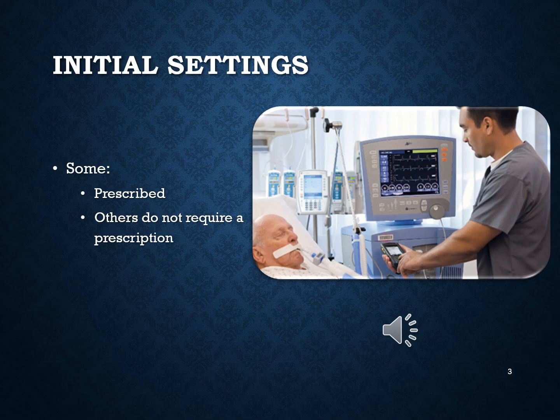Some settings will be prescribed for you, and we'll talk about each one of those here shortly, but I do want you to know that there are some settings that will not be prescribed for you, and those include settings like your flow trigger and your inspiratory time. Now, one of the most important things to know is that your prescribed settings may not always be correct. So you always want to check your prescribed settings just to be safe. And one of the more important ones to check is that tidal volume.